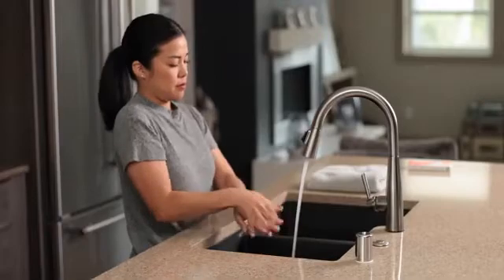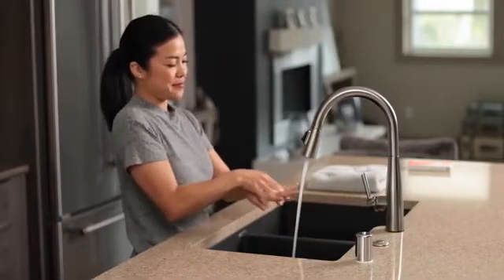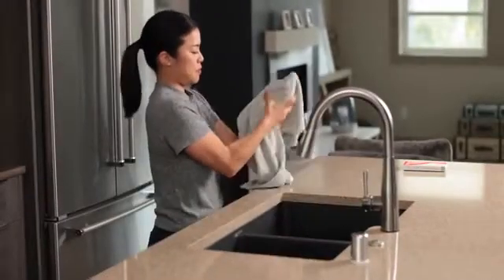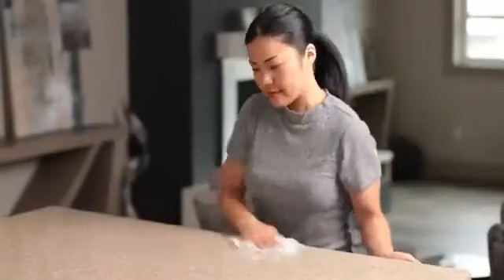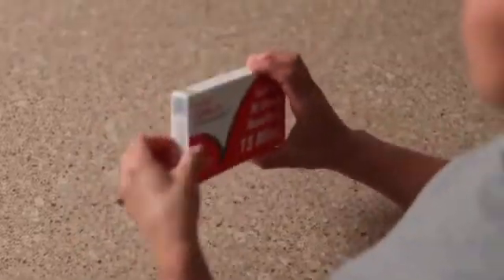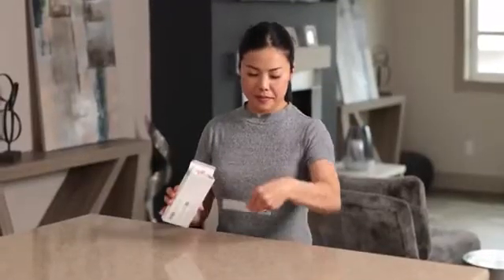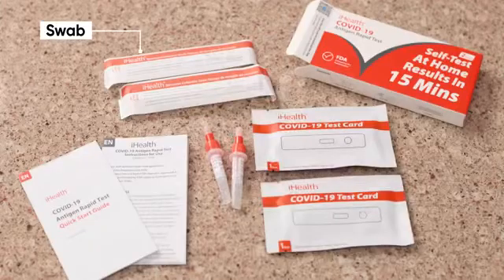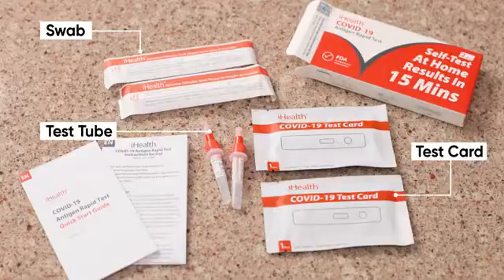For starters, thoroughly wash your hands with soap and water. A good scrub down and some disinfectant is perfect. We also need a clean, flat testing area, so take a moment to disinfect some counter or tabletop space. Once it's dry, lay out the following items from your kit, but don't remove them from their individual packaging just yet. A swab, a test card, a test tube.